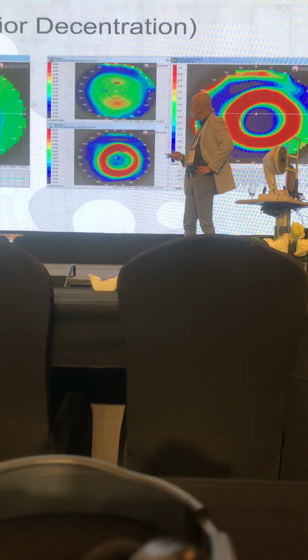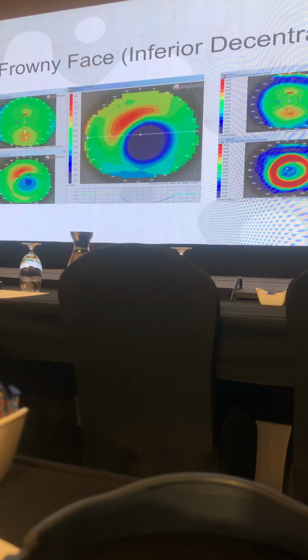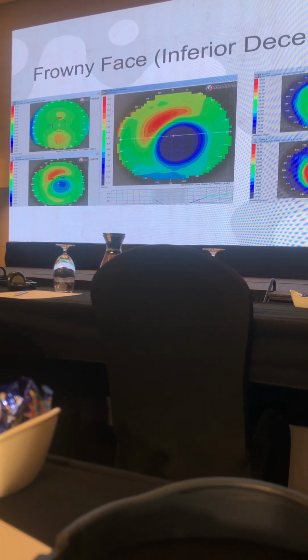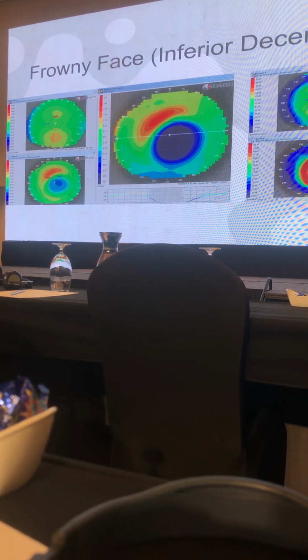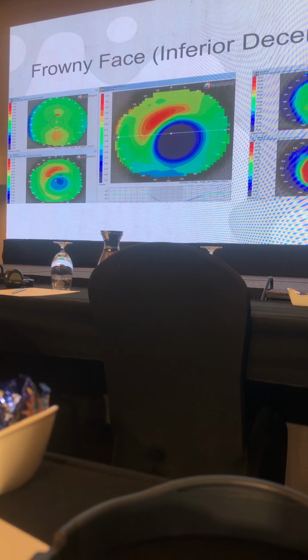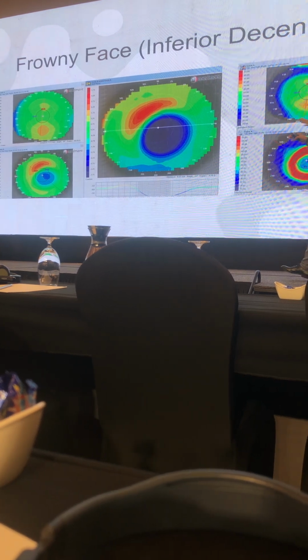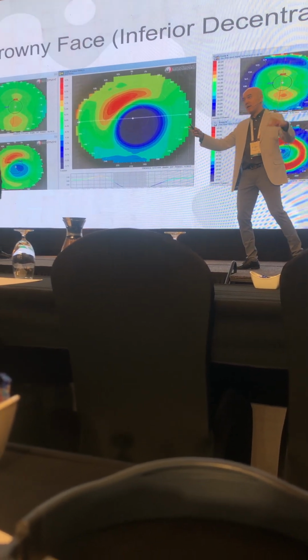Also, I would like to point out, you look at this axial map. You see the lens, just now, as Ollie said, the water will move to the lower area. And the lens, when you fit it on the cornea, will settle into equilibrium. The best equilibrium point is that it will move to the steeper area.